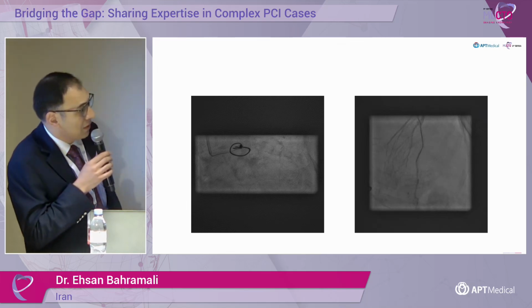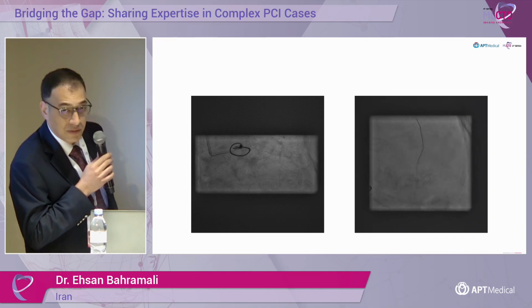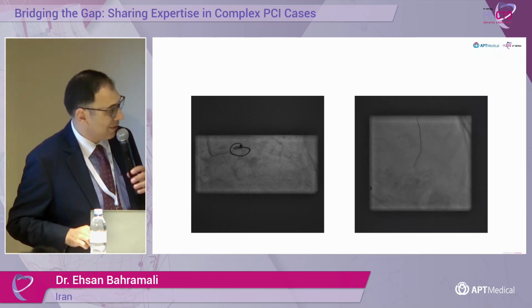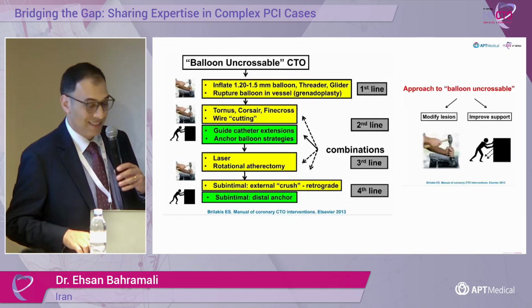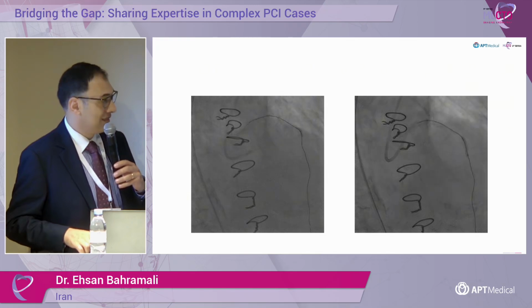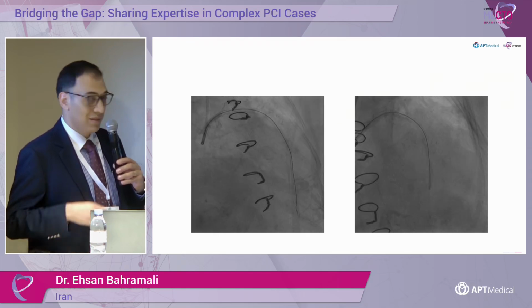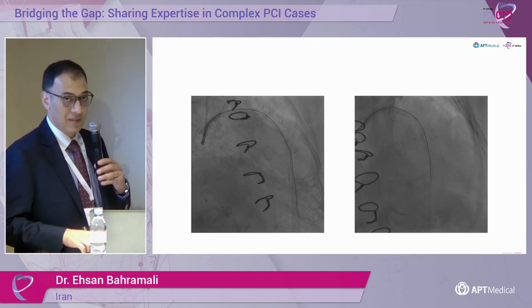This is the injection from the left radial access via the Lima. You can see there are no diagonals here. A lot of septals, but yeah. We have septals, but the numbers decreased. Yeah, we have lost a couple of them. The reversal of the flow actually causes the ischemia. Yeah, that could be it. Two weak septals, we have lost them because of the reversal of the flow, as Dr. Ahmed said.